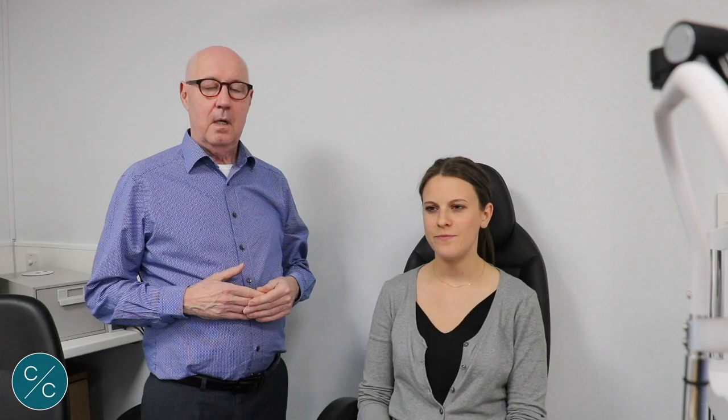When it comes to putting lenses in for the patient, most textbooks will tell us to put the lens directly onto centre. Now this can be quite intimidating for a patient, especially a new patient. So what I'd like to share with you now is another technique of actually putting the lenses in from the white of the eye.